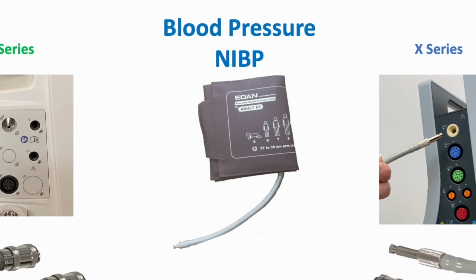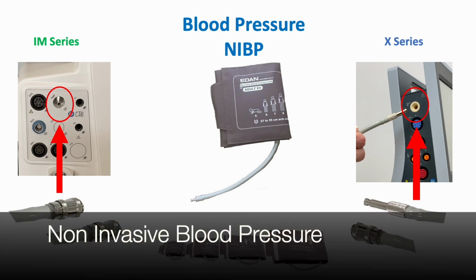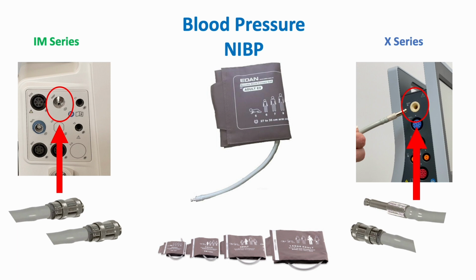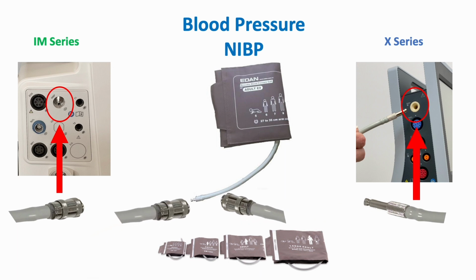Blood pressure. Connect the blood pressure hose by firmly pushing the connector into the port labeled NIBP. NIBP stands for non-invasive blood pressure. The IM and X series have ports that are different on the monitor side. However, the blood pressure cuff connectors are compatible with both. In either case, firmly push the connectors into place and pull back on the collar to release.